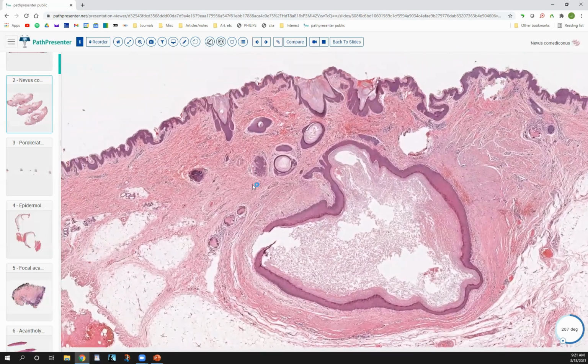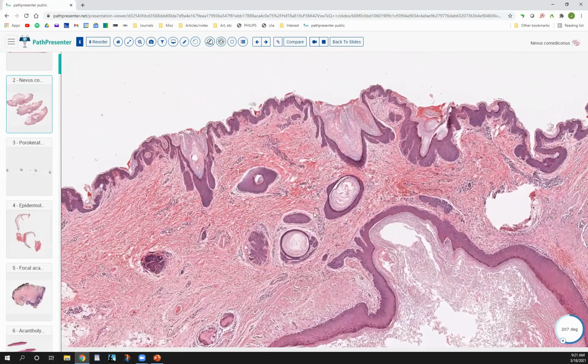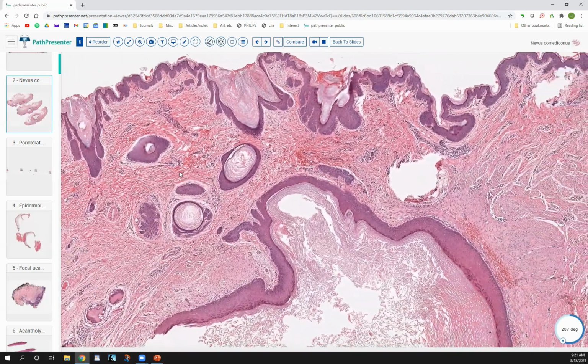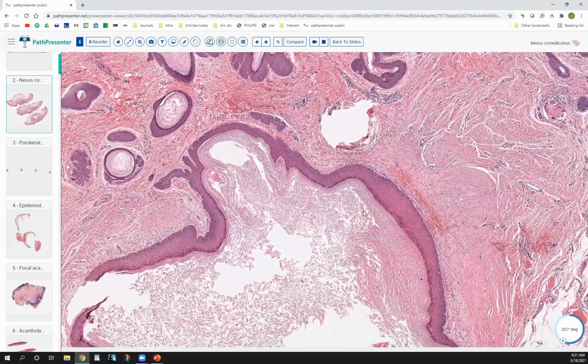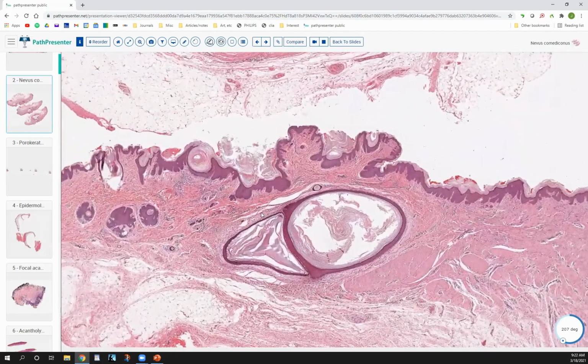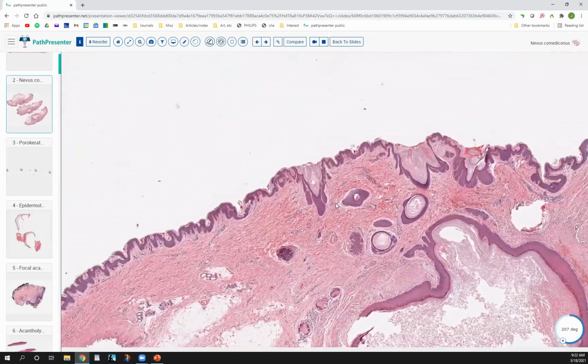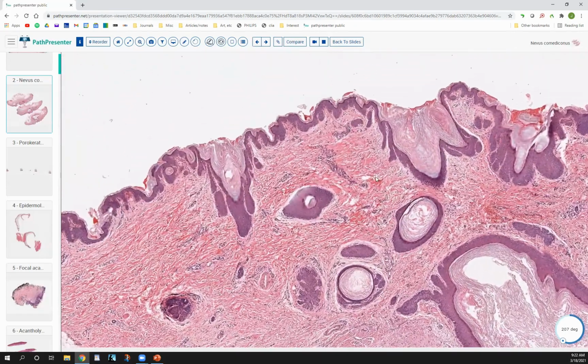And you can see how it resembles in many ways a dilated pore of Winer. And some people actually think that this might be a subset of an epidermal nevus syndrome. But it's fairly distinctive. I remember just epidermoid cysts, multiple, many of which open up to the surface, like this field here, which we're seeing right here.